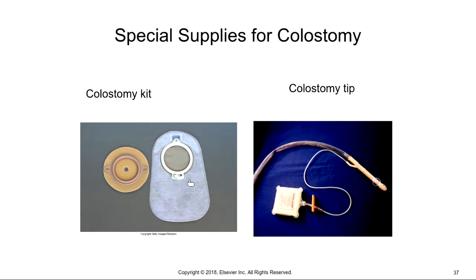So, all right, that is a colostomy kit. That is on page 510. And then you or the radiologist would put this tip into the section of bowel that you're looking at, whatever's coming out. This flare disc is actually on the patient, and this opening can be made bigger to allow more of the intestine to come out. And then it's usually stitched so that the hole is smaller on the patient's actual abdomen, because you don't want that section of intestine slipping back into the patient.